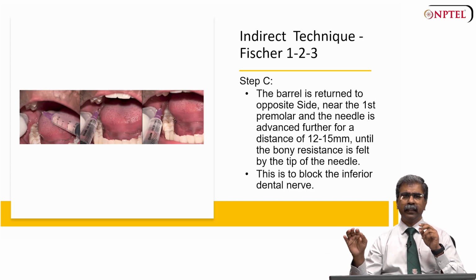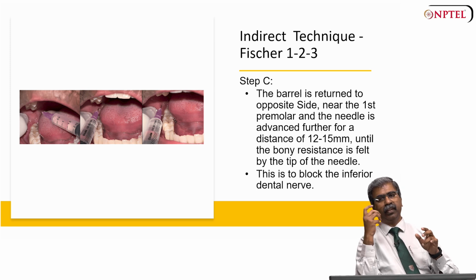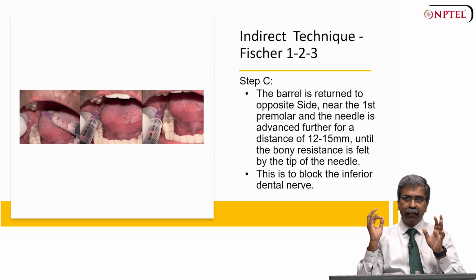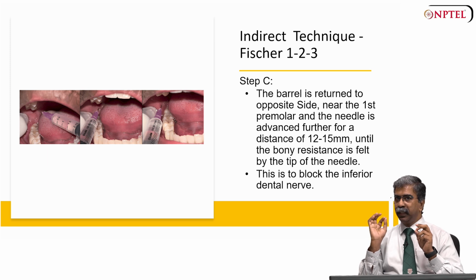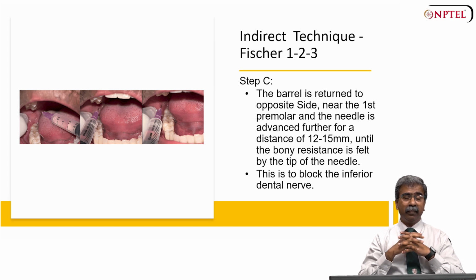Next is the third step. The barrel is positioned over the first premolar on the opposite side again. That is, you swivel the barrel to the opposite side, and then the needle is advanced 12 to 15 millimeters until bony resistance is felt. This indicates that the needle tip has reached the target area for the block.